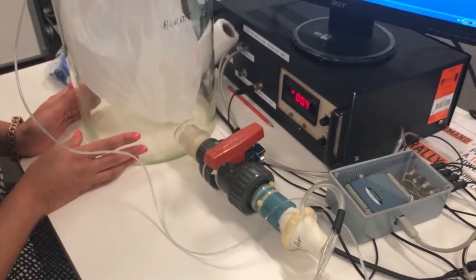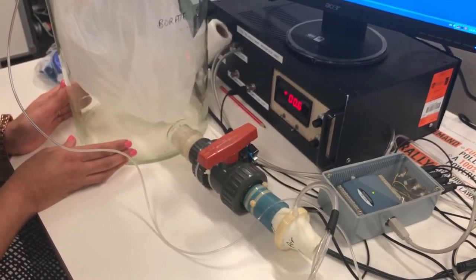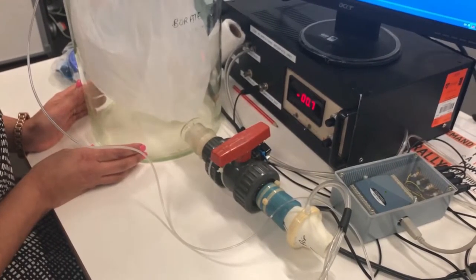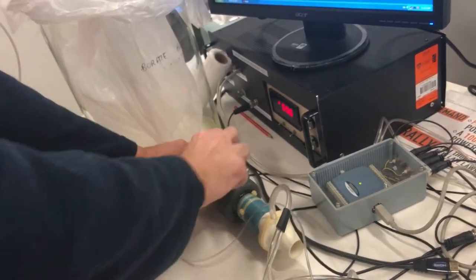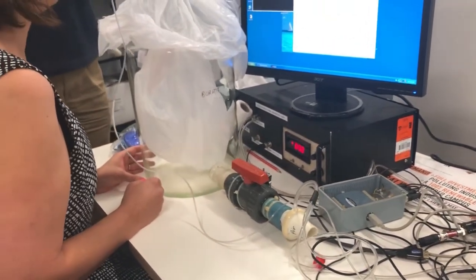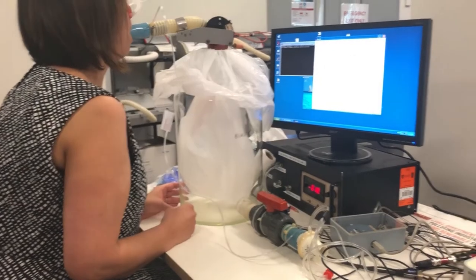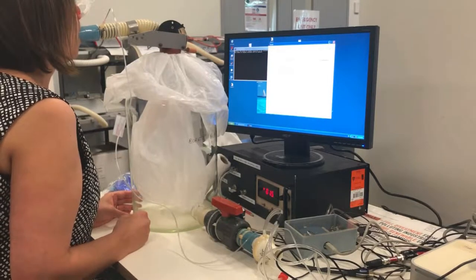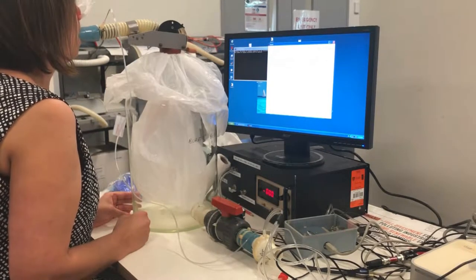The breaths are usually a bit longer and deeper now, as the student tries to get more oxygen in, but the restriction prevents that so it is more of a struggle. We still need five breaths; the second restriction breaths usually get detected more easily than the first ones. After the second restriction we usually let it go up maybe one or two more mmHg — we stopped at about 75–76 so we'll wait to 77 to get that extra data, which lets the software automatically plot it a little more easily.